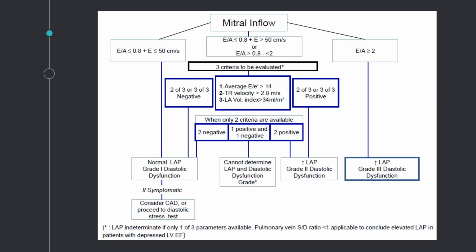I'm going to add one more point: I do agree with you. I think the indeterminate is potentially an issue. You probably know about some of these studies, Chiming, but there are studies that use artificial intelligence to try and differentiate further, bringing in a few other echo parameters to determine the presence of diastolic dysfunction and grade it. That's a little bit more nuanced, but because you use AI technology, it's just a matter of collecting the parameters, feeding them into an algorithm, and then it'll give you a bit more discriminatory data. In part, I think some of the parameters have a little bit more weight with regards to diastolic dysfunction than other parameters. Yeah, that's Dr. Pavosam Gupta making his career on this one, looking at multiple parameters in diastolic dysfunction and some clinical data as well.